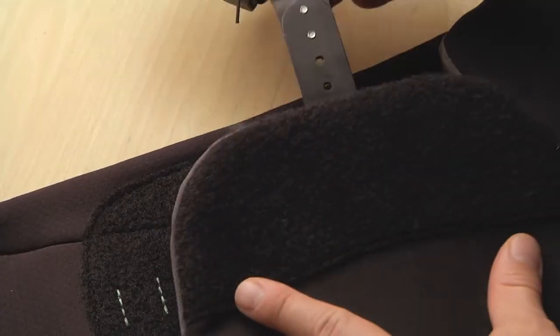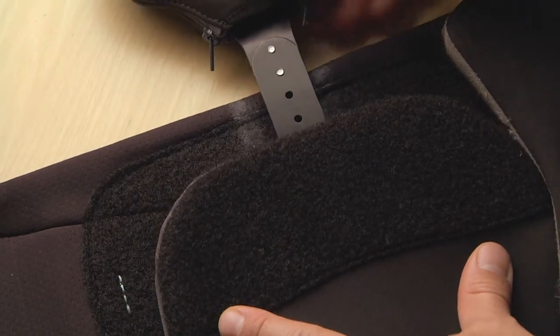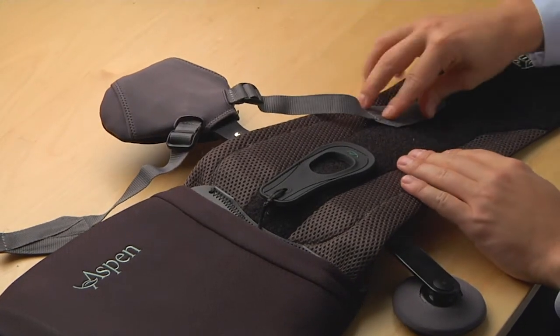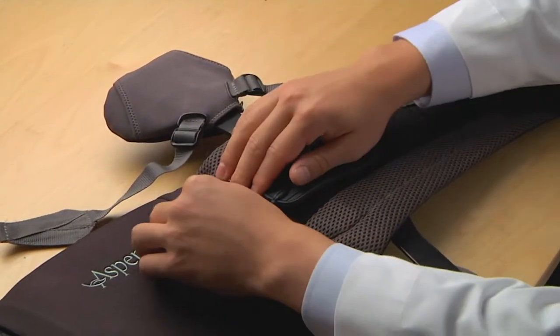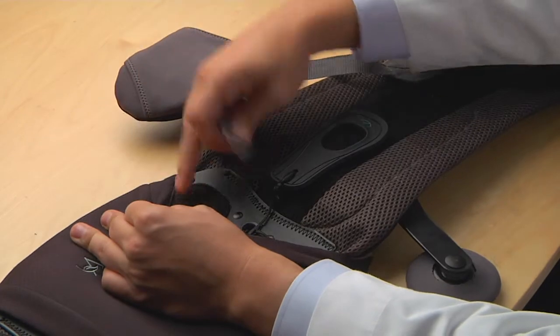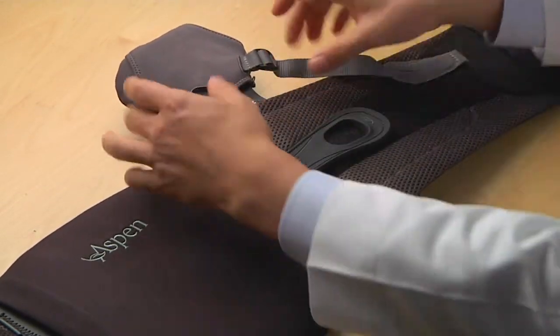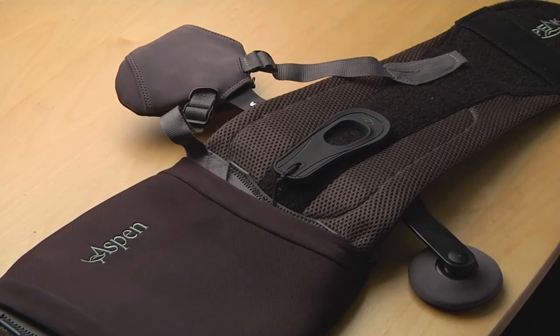Press down to secure. Attach the anterior tension strap as shown and press down to secure. The posterior tension strap connects to the loop material on the tightening mechanism as shown. Do not tighten the straps at this time.